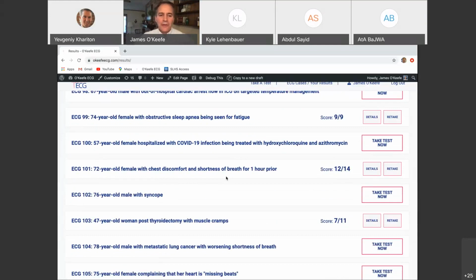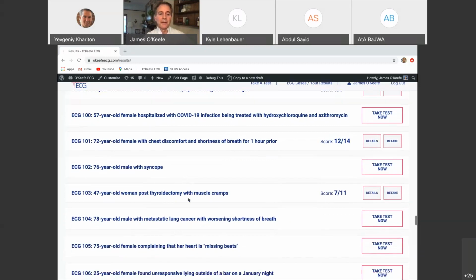Yeah, PR depression is definitely something that I can't tell you the specific sensitivity and specificity, but I can tell you that it's definitely one of the things that makes you strongly think about pericarditis when you see it. To my eye, there was maybe just a hint of it in lead 3 there. But like with a lot of things, it's the constellation of findings. When you see concave upwards ST elevation in everything except aVR, and somebody with pleuritic or positional chest pain, if you see that PR depression, it kind of cinches it. Here it was a bit of a red herring, but it's definitely something to pay attention to. You'll usually see it with florid pericarditis.